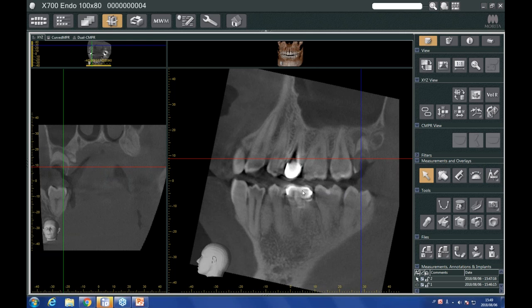parallax. Now, for those of you who haven't heard the term parallax, if you can imagine very basically cutting a carrot, all right? If you cut a carrot directly in half and you look at that carrot, it's going to look like a nice round circle. You know, it'll have the root in the center and no distortions. It's just a nice, beautifully round circle. But if you went ahead and cut that carrot at a 45-degree angle and looked at it that way, it's not going to be a perfect circle anymore. It's going to be more of an oval.